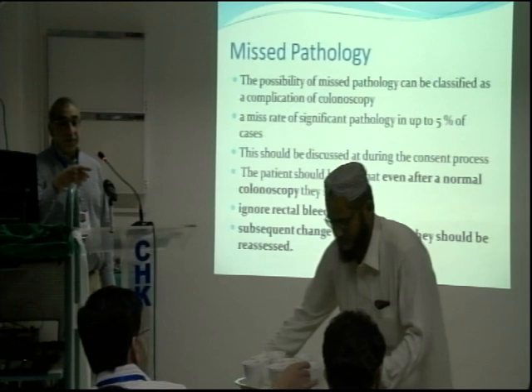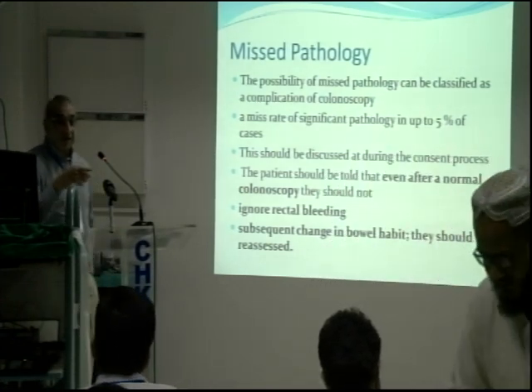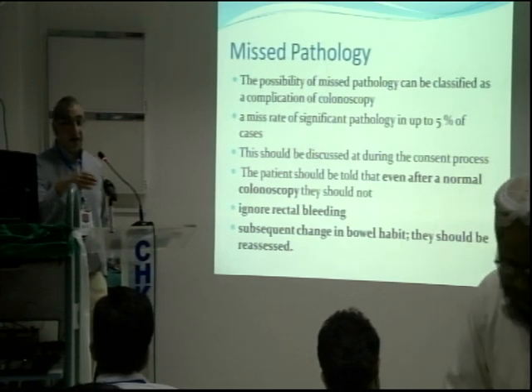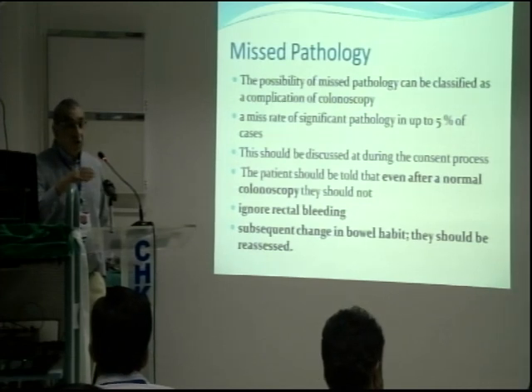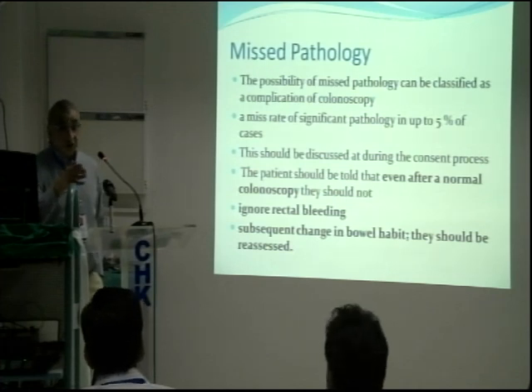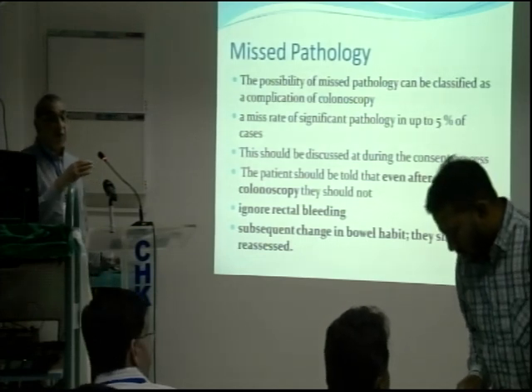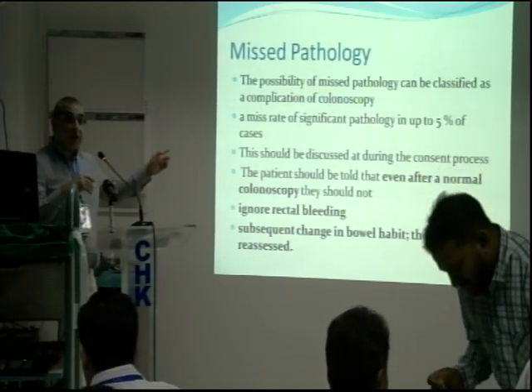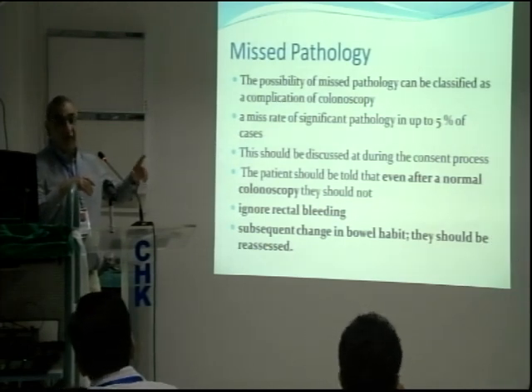So for adenoma detection rate, the BSG guidelines, or the JAG guidelines in the UK, state that the minimum ADR should be 15%. Most of us who do regular colonoscopies have ADRs of well over 50%. So in most of our colonoscopies, we pick up lesions. That's why your withdrawal time from cecum to rectum should not be less than 6 minutes. Minimum is 6 minutes. The more, the better.